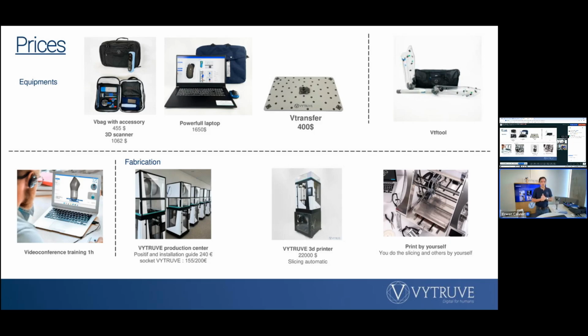You can see on the screen that to start with digitalization, it's necessary to have the 3D scanners. The 3D scanner is not very expensive. It's around $1,000. And you can also have the V-bag accessory to have everything in one bag.